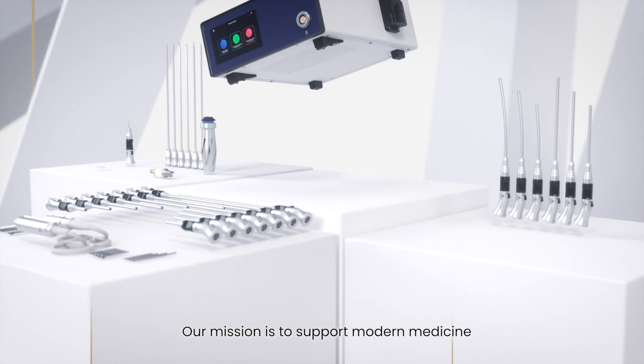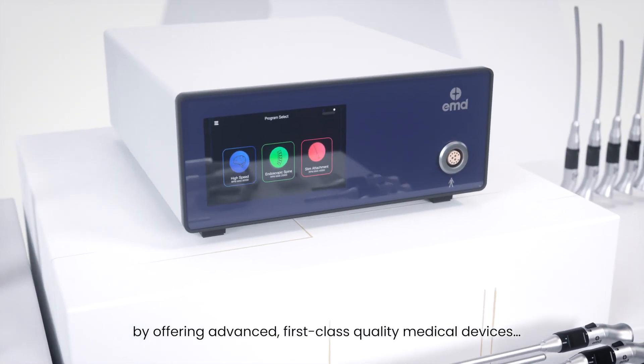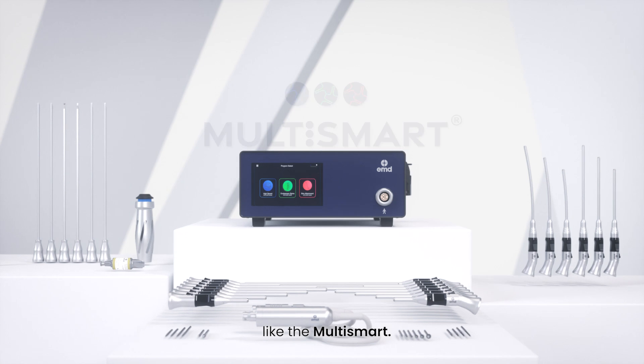Our mission is to support modern medicine by offering advanced, first-class quality medical devices, like the Multismart.